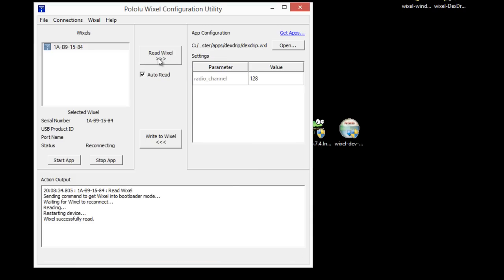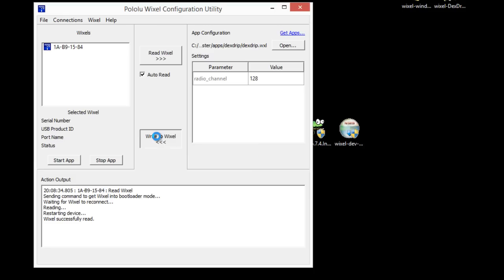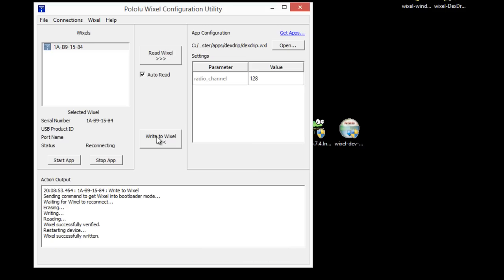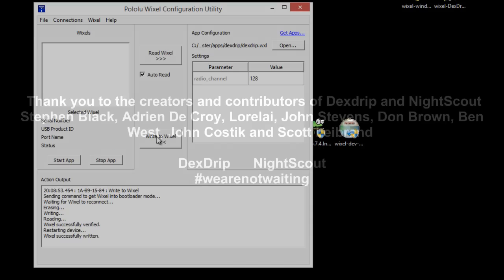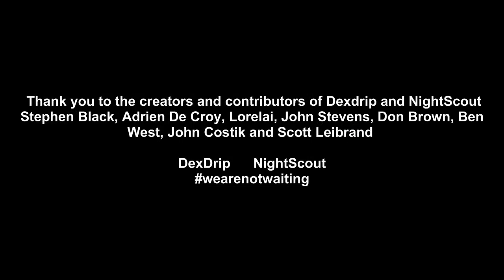And now if we hit read, I've already done this before so it just reads what I wrote last time. And in this case it has the software. So now we can just go ahead and write that to the Wixel by hitting that button there. Just wait till it comes back up on the left. Now hit write to Wixel. The Wixel will flash the LEDs, and then it'll just do a single green LED for a second or two, and then you're done.